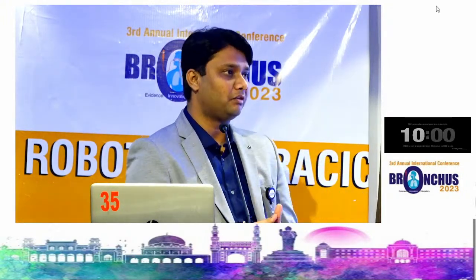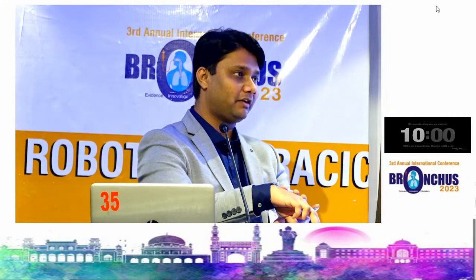Sir, actually, there is an option of scaling down the movements from yours to the robot, like 2:1 or 1.5:1. So if I'm lifting and applying a force of 1.5, it will actually be transmitted to the patient as 1. So you have that option on the robot. The thing is, you have to have a clearer vision so that you don't do anything stupid, like pulling. Definitely the instruments are very strong, and if they go inside, they can cause a lot of damage.